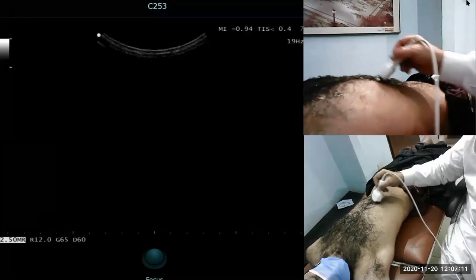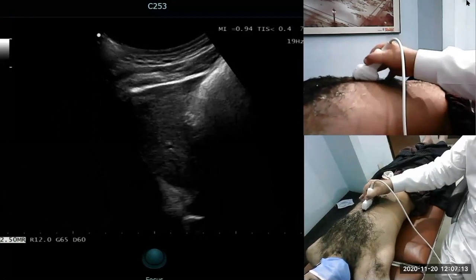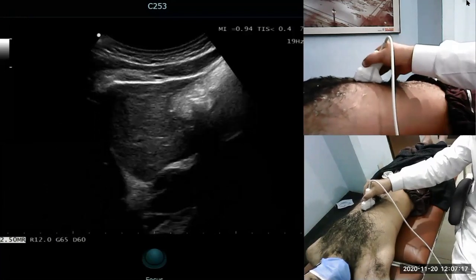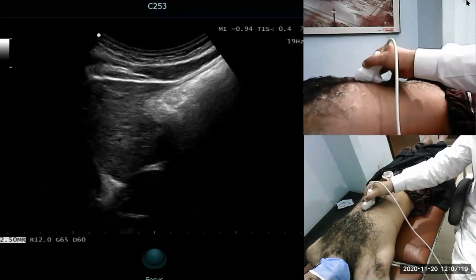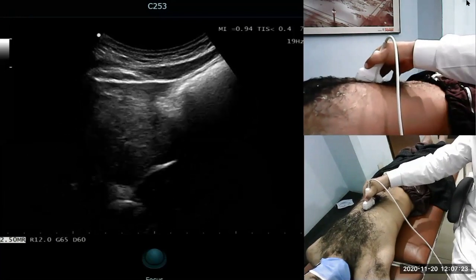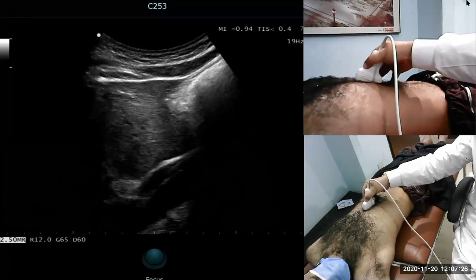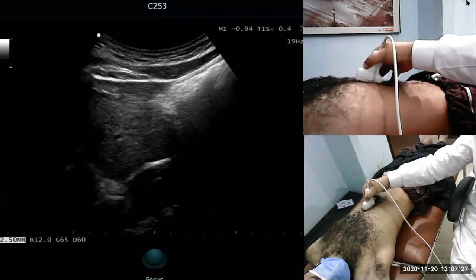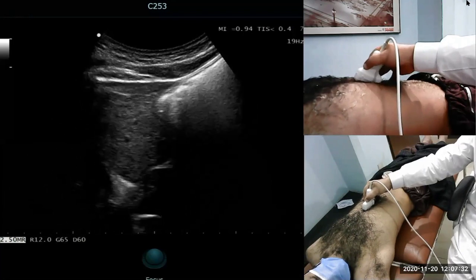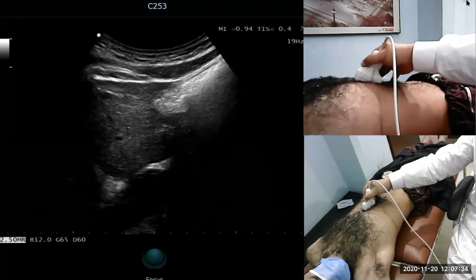I must tell you that the idea behind is to look for an asymptomatic finding in an individual who is otherwise absolutely considering himself healthy and is not having any complaints whatsoever.